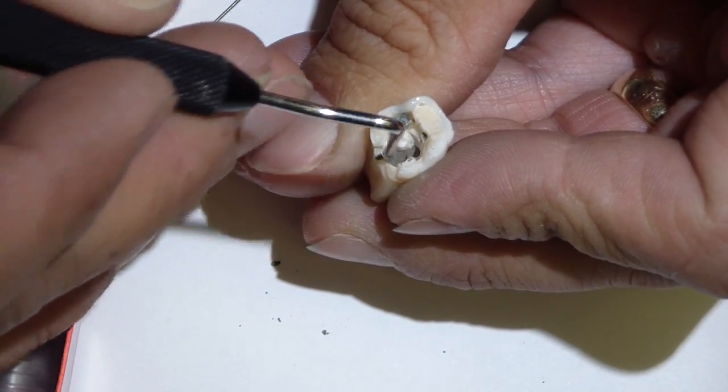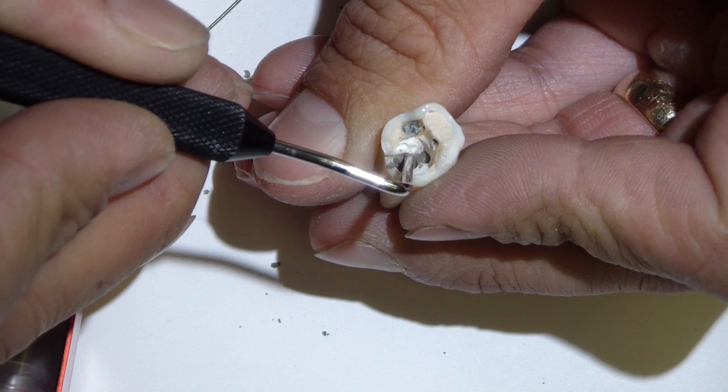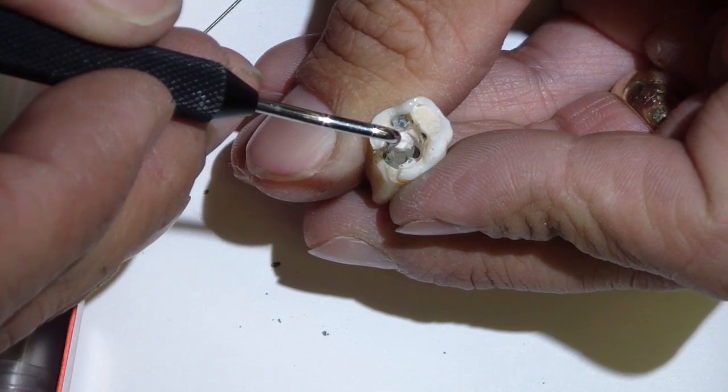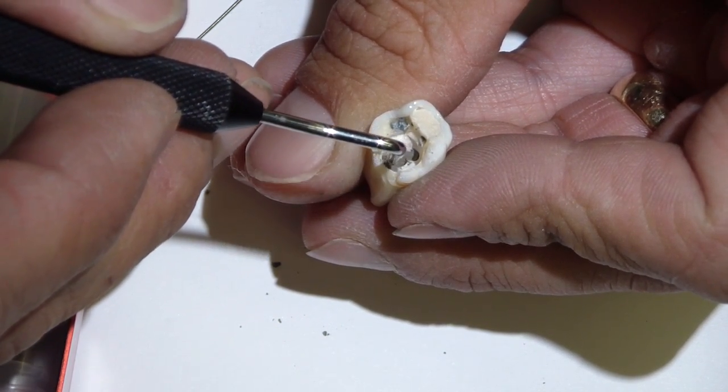In this case, we could place another layer of MTA, and then place our restoration, whether we're completed with the endodontic therapy or our provisional restoration or whatever.